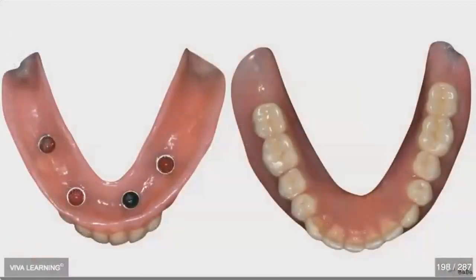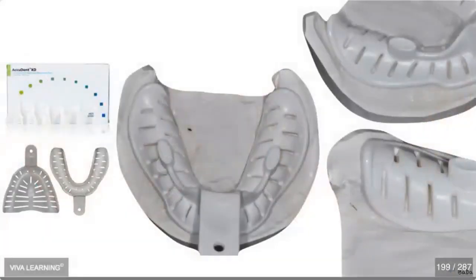What I did is I made a base plate and wax rims. And you can notice here that the dentures are short on the retromylohyoid fossa, short on the buccal shelf, and all the flanges all around are extremely short. So what I did is I took some AccuDent XD trays. These are heat moldable. So I put them in hot water, and then you put them on the cast and mold them on the cast. You notice here that they were short of the retromolar pad area.